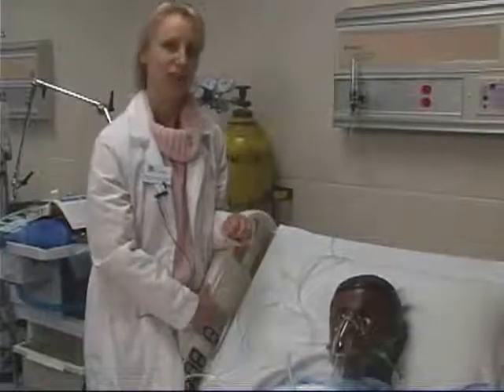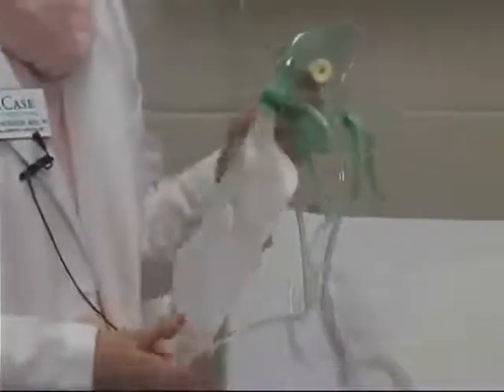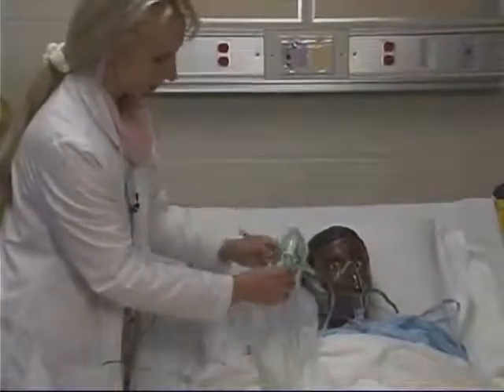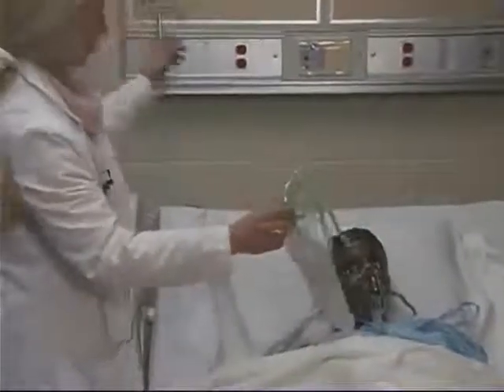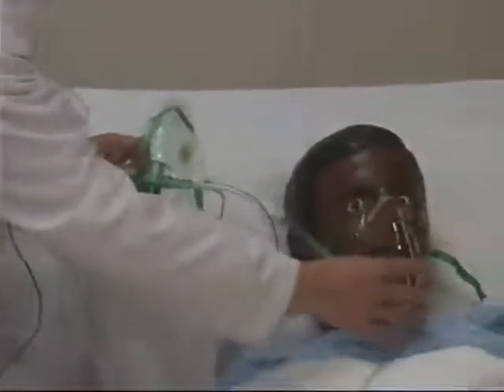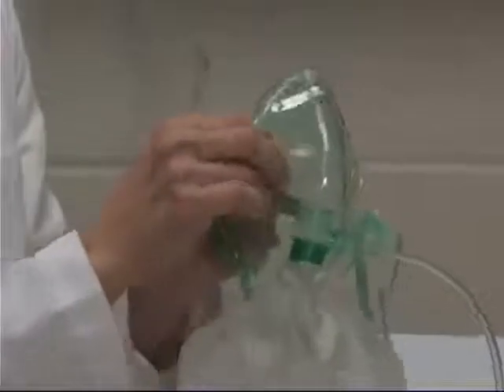Now I'm going to talk about an oxygen delivery device called a partial re-breathing mask. As you can see, the mask part looks similar — it has a strap that goes around the patient's head and tubing that hooks up to the oxygen source. A couple of the main differences compared to the simple face mask are that there's a reservoir bag, and the side ports may have rubber flaps on them.